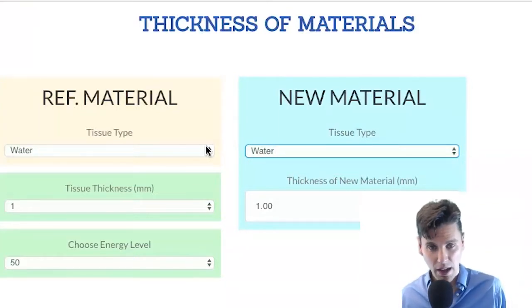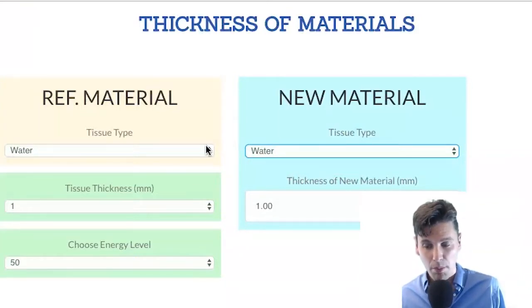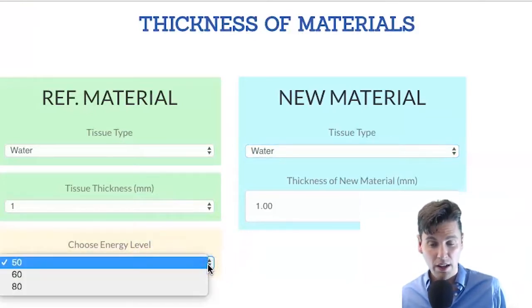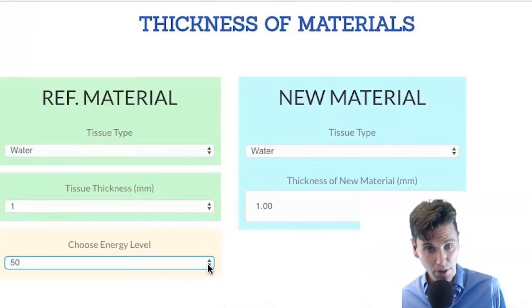We have it that way just to keep the model simple, but we have to remember that the X-ray attenuation depends on both the material and the energy level.